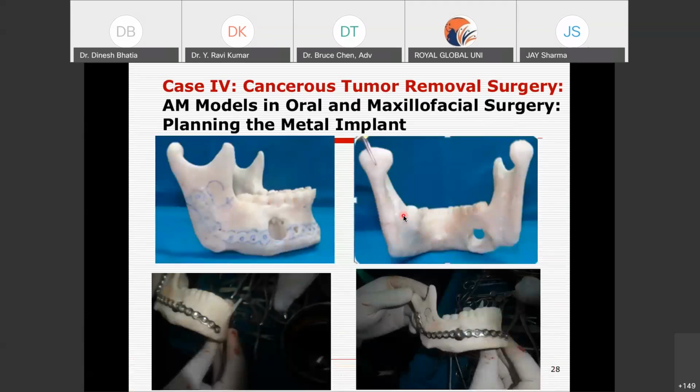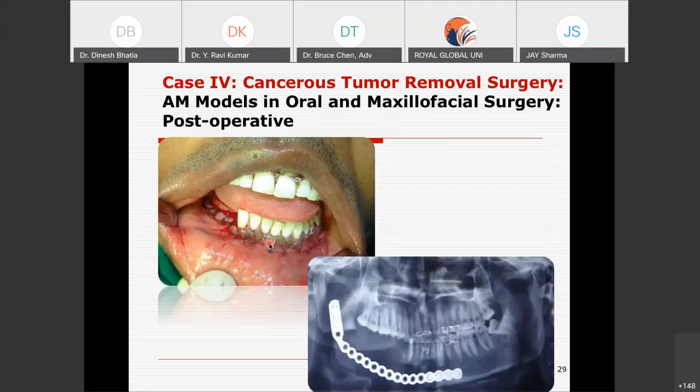So what we understood is that there will be several procedures to implant it, but we could not implant for this case because of clearances, certifications, and other procedural things. What we were able to do was give them these models for conventional plates. They have done it the conventional way, but still they approached us, asking whether we can do the surgery. Because it was not a successful surgery, we developed the implant, and asked whether it could be implanted. So that's the situation.